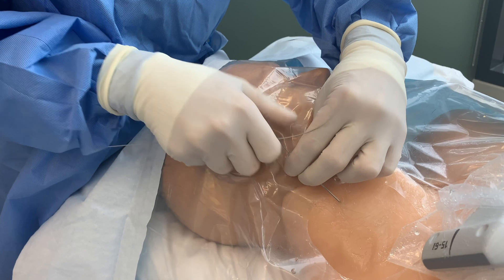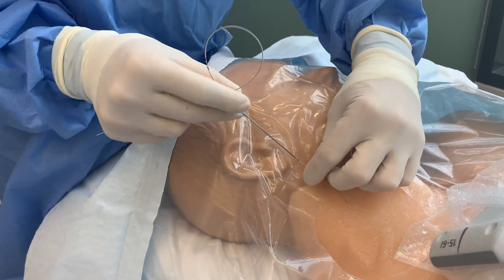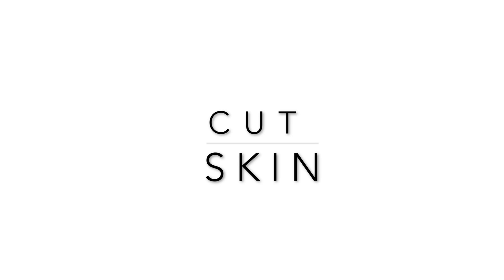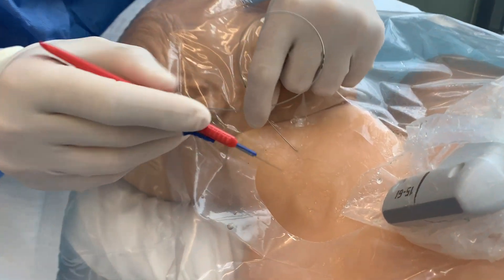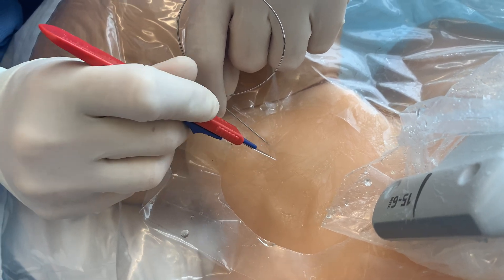Slowly remove the needle while keeping control of the guide wire. With the scalpel pointing up and directed lateral to the carotid artery, create a small nick in the skin large enough to accommodate the dilator, being sure not to cut the wire.